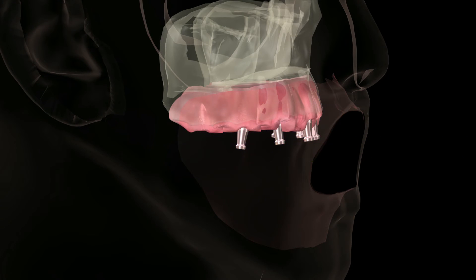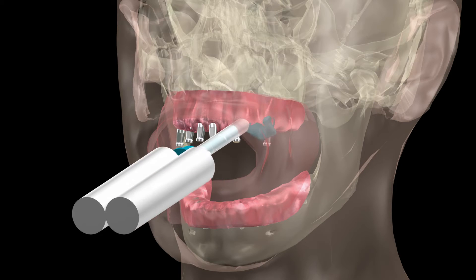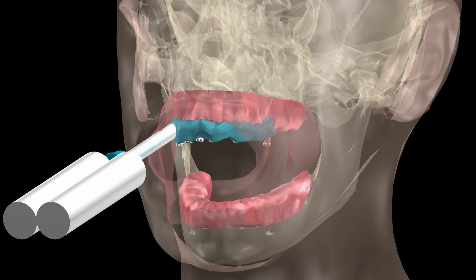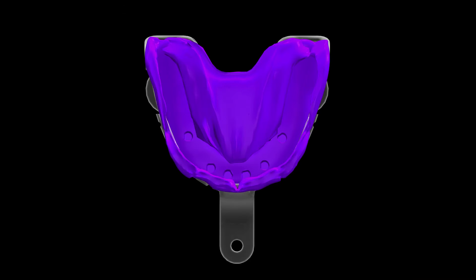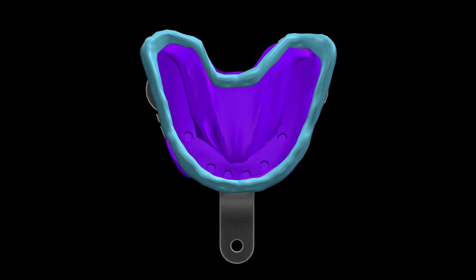Inspect and then perform a final wash impression. Apply a light viscosity PVS directly over the implant copings in the mouth and into the tray interior in all areas, except the implant copings.